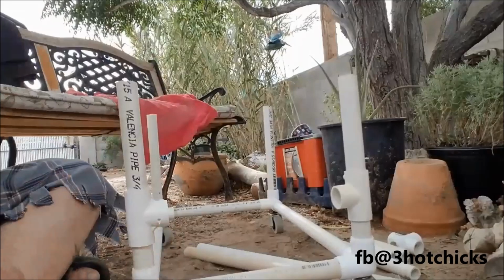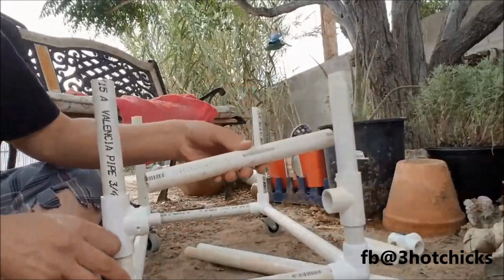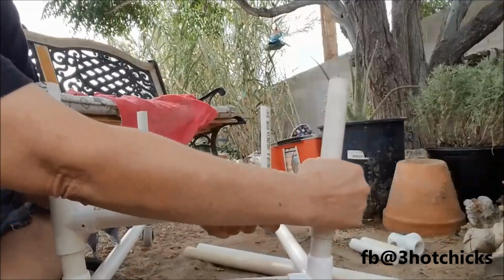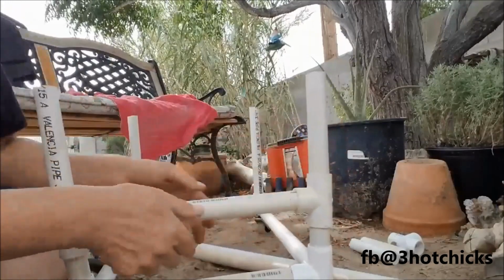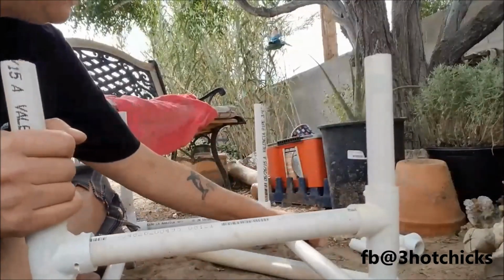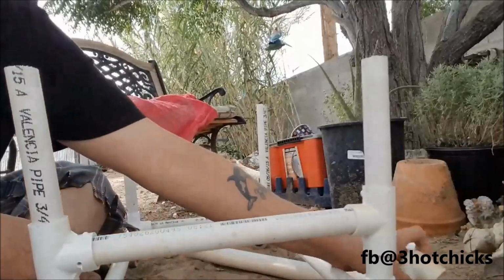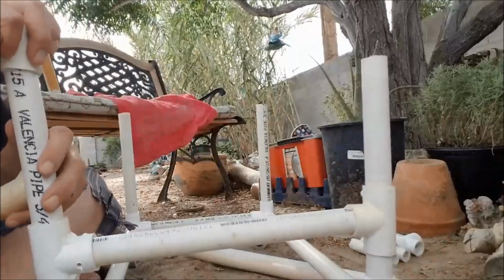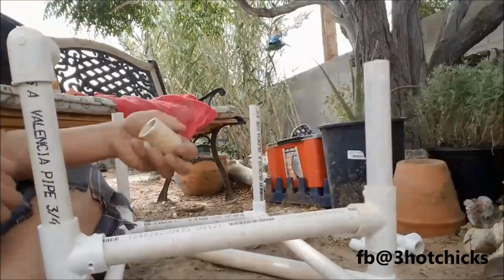So then I'm going to take my other lengths, my width here, and I'm going to attach it to the T here in the front. And those are on the T in the front. And then on the top part, for the front, I've got two-way fittings. So you're going to add it here to the top, and then another one on the top.